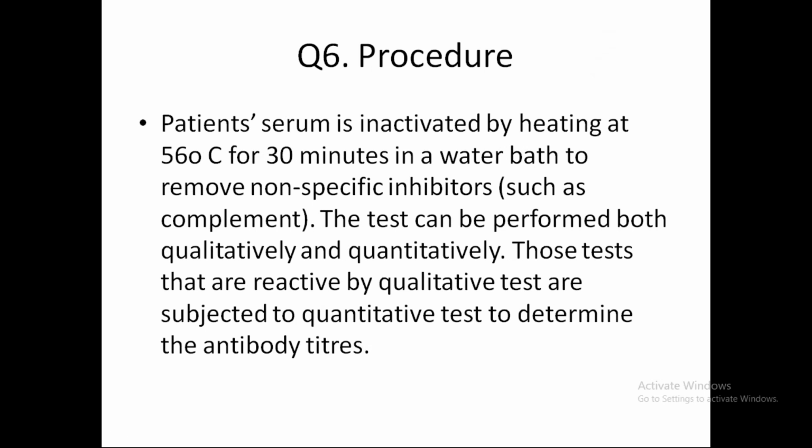How will you perform the VDRL test? Collect the patient's blood sample and separate the serum. After taking the serum, you have to inactivate it. You can inactivate the serum by heating at 56 degrees centigrade for about 30 minutes in a water bath.